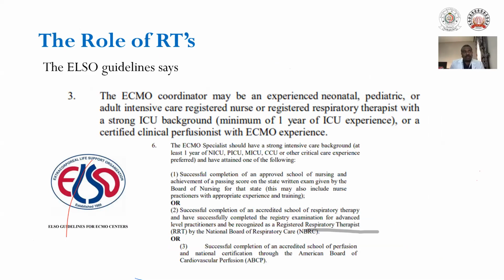In this particular slide, I'm showing a logo. This is ELSO, the ELSO guidelines. ELSO is the international organization which maintains a registry for ECMO cases and provides guidelines for establishing ECMO and extracorporeal life support measures. As outlined in these guidelines for setting up a center for ECMO, the institutional requirements are needed for the effective use of ECMO. RTs are an integral part. I just took a screenshot of their guidelines.